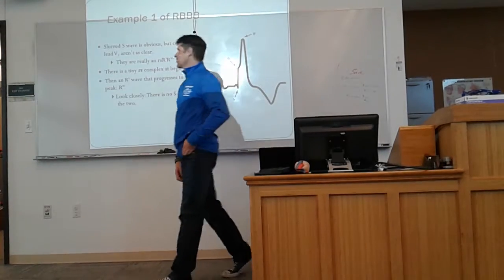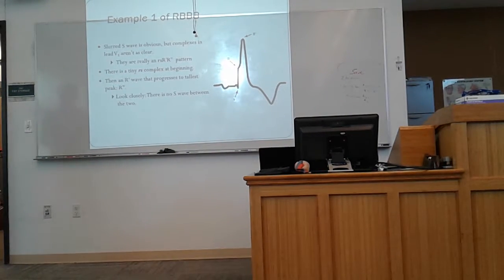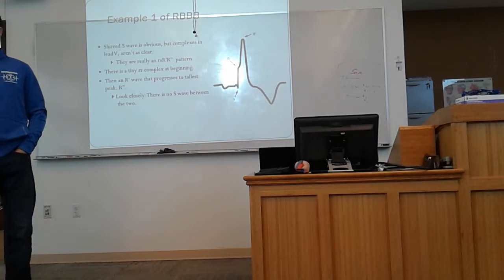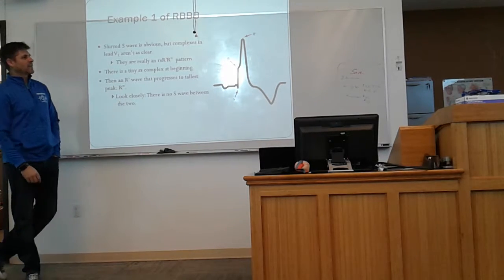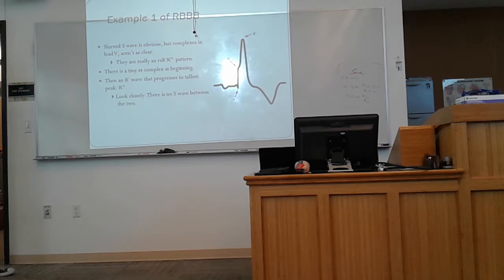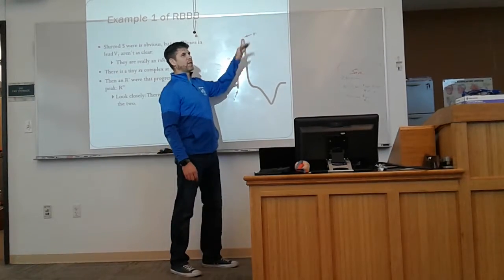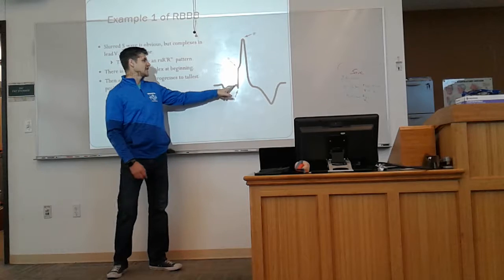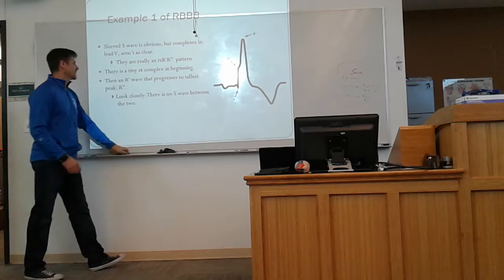The RSR patterns can be weird and abundant, just depending on what I talked about before, how often the signal gets into autorhythmic cells and out of autorhythmic cells. So you might start to see multiple types of patterns on the R waves, but in a right bundle branch block, all of the R waves that are related to the left side are tiny. The largest one is going to be the right-sided one, and it'll be the last one, whatever it is. But you might see tiny little bumps, or you might see something like this.